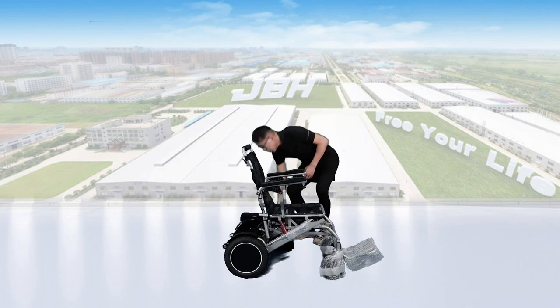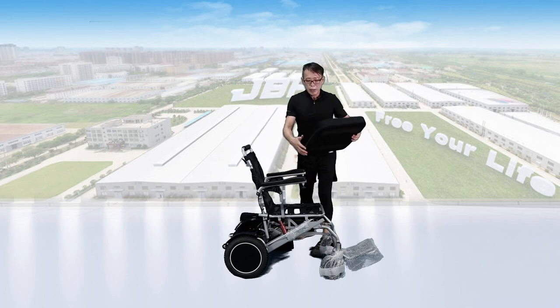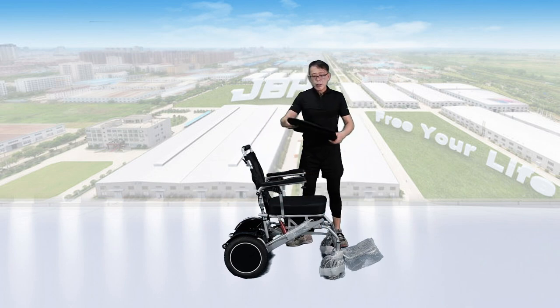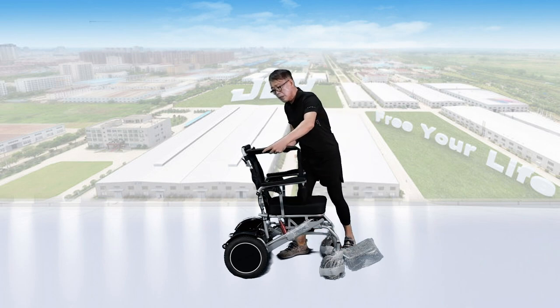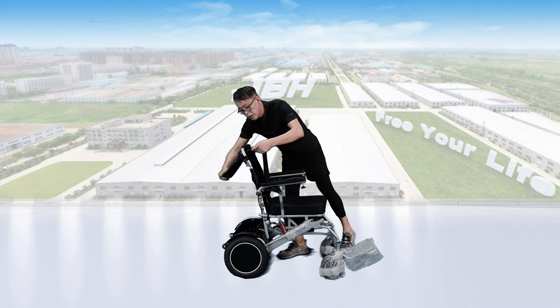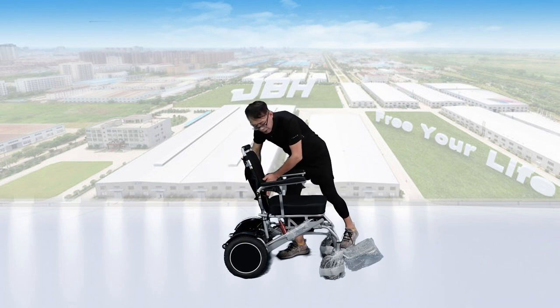Let's set up the seat cushion right on top of the seat here, and also the seat-back cushion — keep the logo facing the back. Insert it right into the space here and attach it to the seat back.